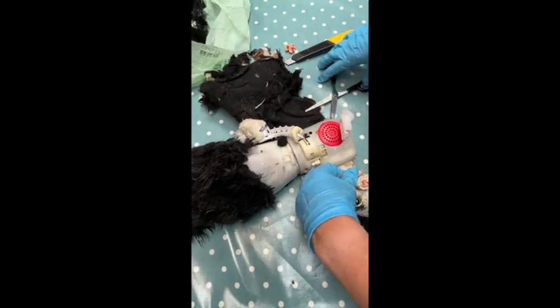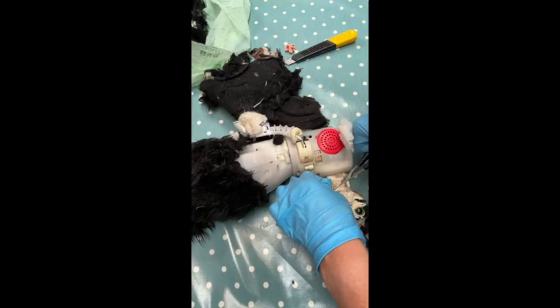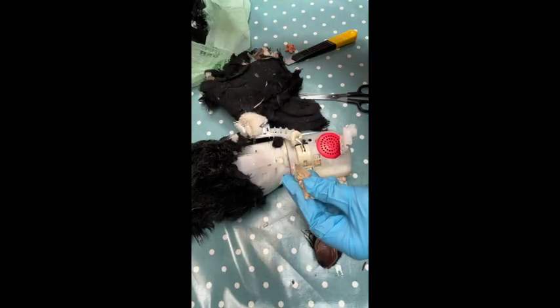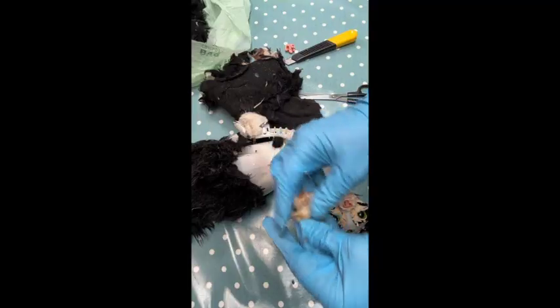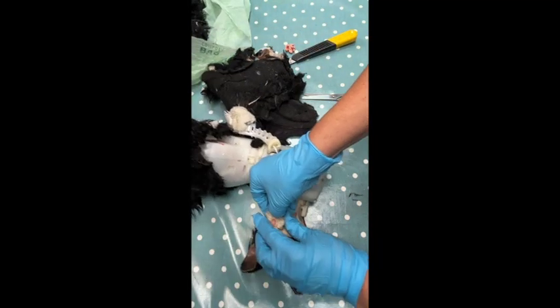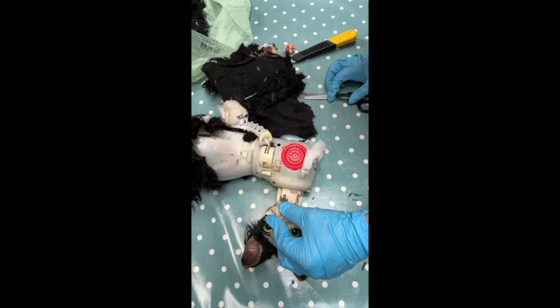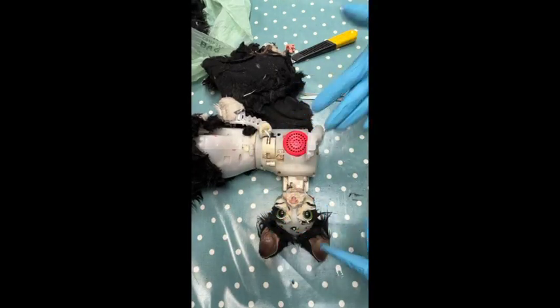The smelliest bit's gone actually, just on the side. This bit absolutely solid. And it's the same with that bit there. So there's lots of food on the side of the mouth, embedded. Right, there's a screw here. Let me get a screwdriver.